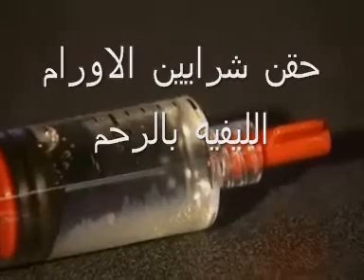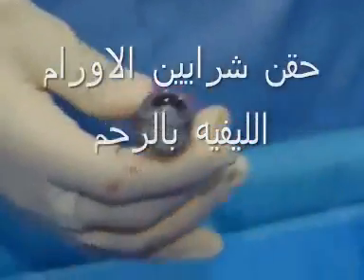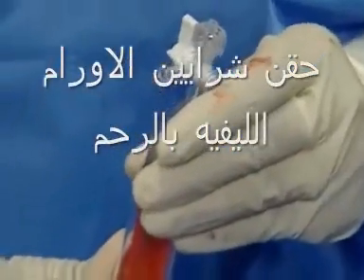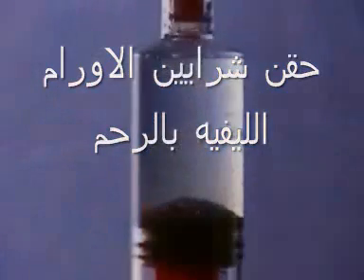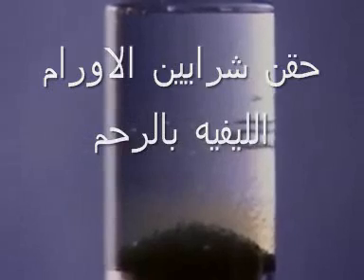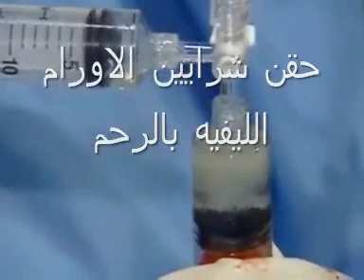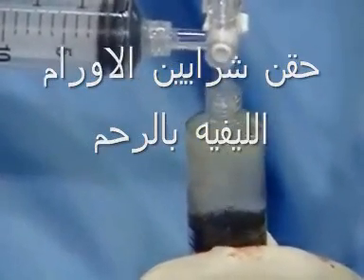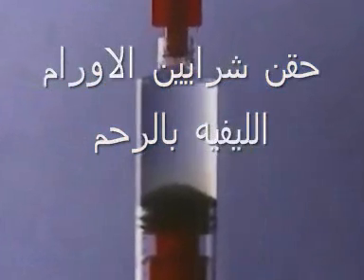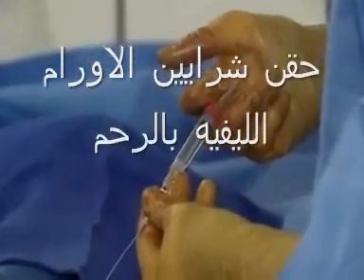Next, the material used to block the blood vessels feeding the fibroids is prepared. Embosphere microspheres, the first cleared embolic material for UFE procedures, are most commonly used. Embosphere microspheres are round, hydrophilic beads made of an acrylic copolymer. The smooth, round surface of the beads prevents clumping within the catheter and the blood vessels, promoting ease and accuracy of delivery, and ensures that the vessels are uniformly blocked. In addition, the elasticity of the microspheres facilitates passage through small delivery systems.